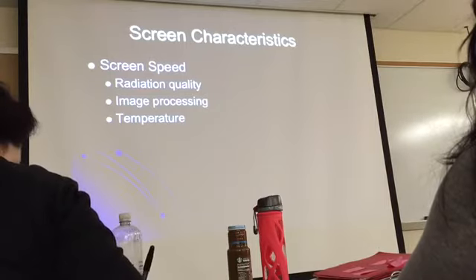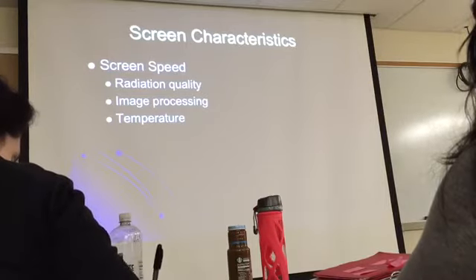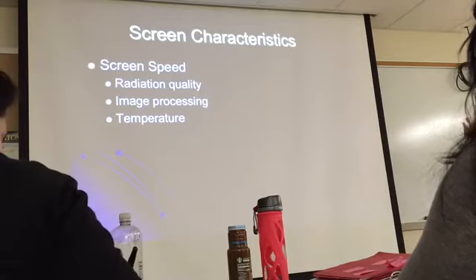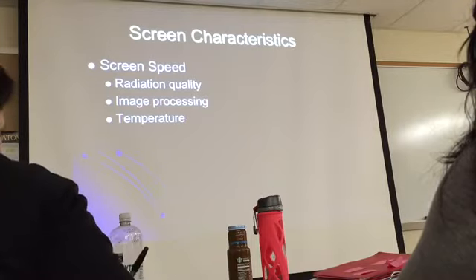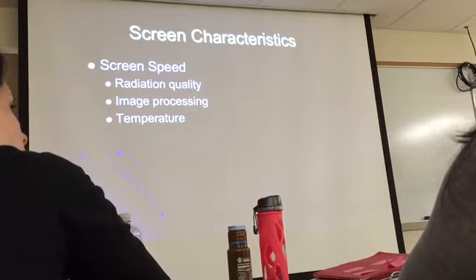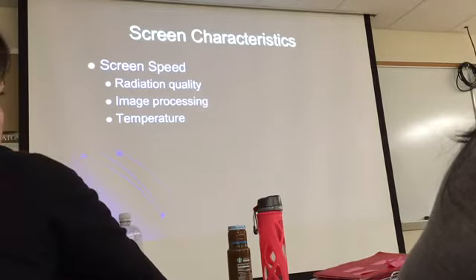In addition to having mammo film and regular radiographic film, they also had extremity film and extremity screens. So they had extremity screens, extremity film, regular screens, mammo film, and mammo screens. So they were the exception.